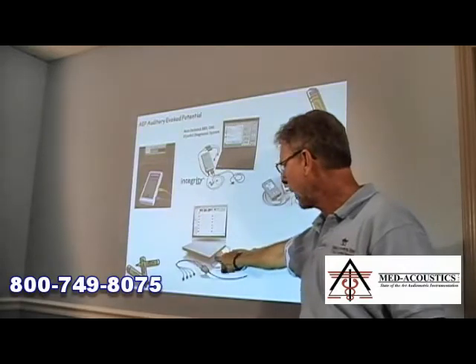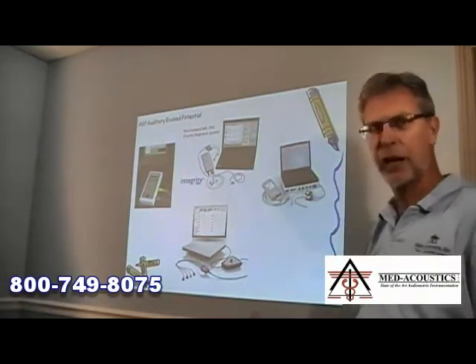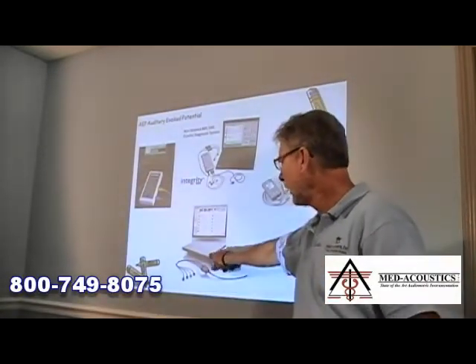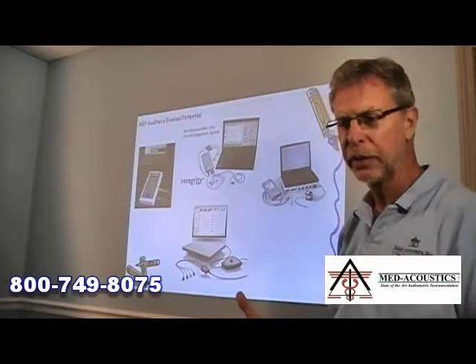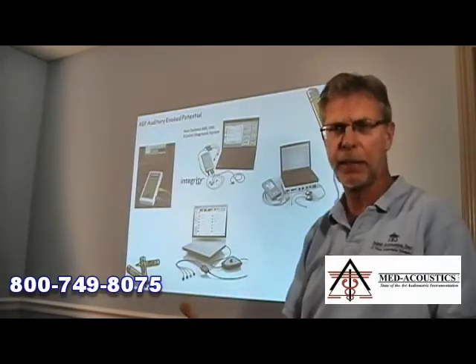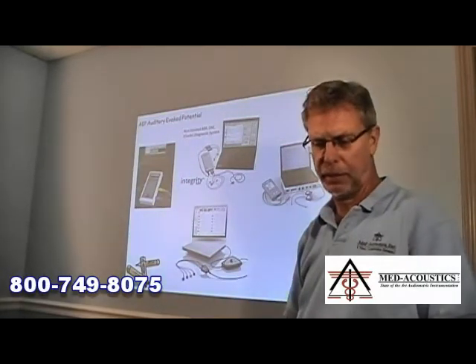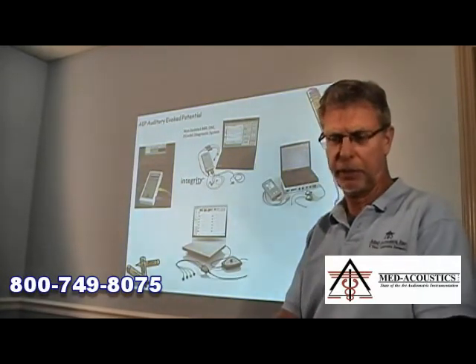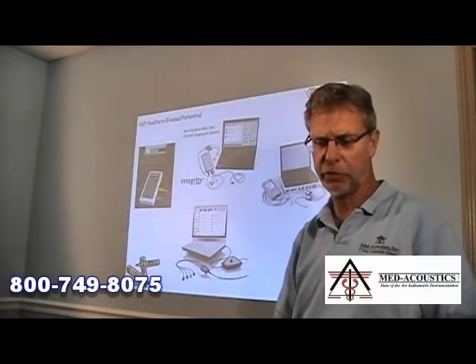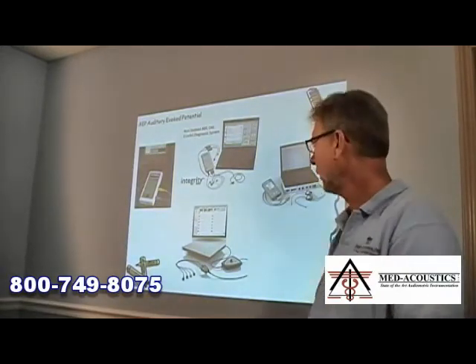It's maybe the size of a notebook computer. We normally sit the notebook computer on top of it, though it doesn't have to be. This unit, that is the actual processor, can even be hidden somewhere out of sight and not take up any desktop space. I put the PC, usually the laptop, right on top of it, because it is about the size of a laptop when the laptop is closed.